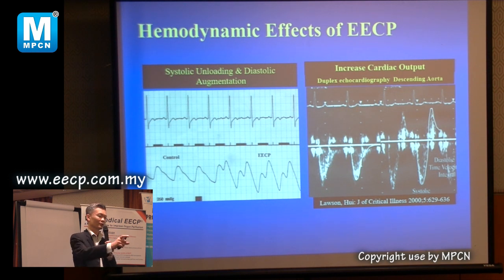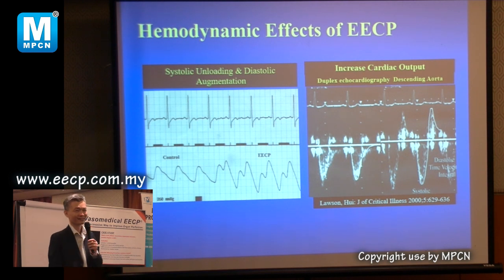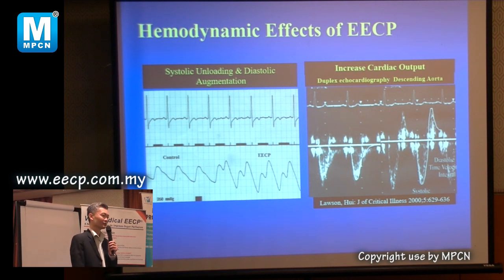You measure it before and after. This test costs around 1,500 to 2,500, and it involves radiation like an angiogram, about 12 to 15 millisievert. So before and after you subject yourself to two radiations, which I also don't want to do, but your ignorant patient may do it because you ask them to. So I won't do it. It's based on the subjective thing: if their symptoms improve, then you can use it.